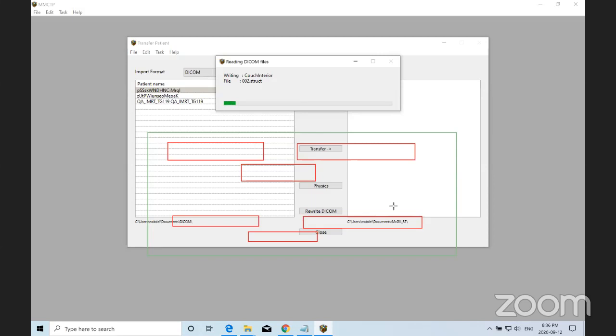I'm going to open up the source code right now. I think it's either going to assume it's an X jaw or a Y jaw. And if you combine both the X and the Y jaw into one CM, that might be a problem. Okay, how about if we have two CMs? That would be an easier approach. Okay. And then you would just have a slightly different divergence based on the height of those CMs.